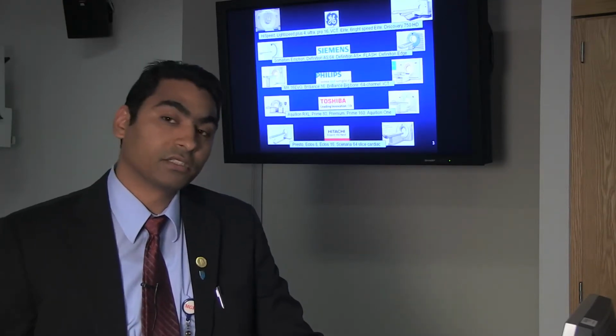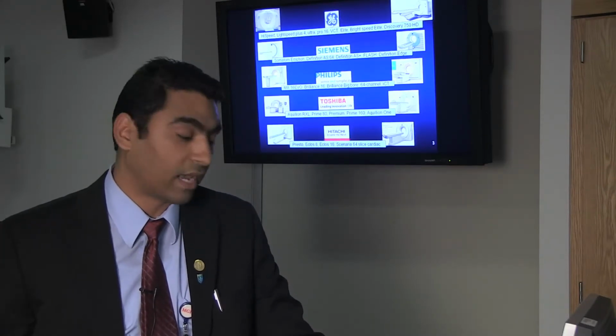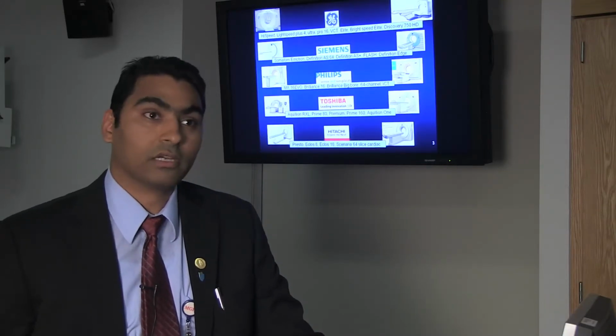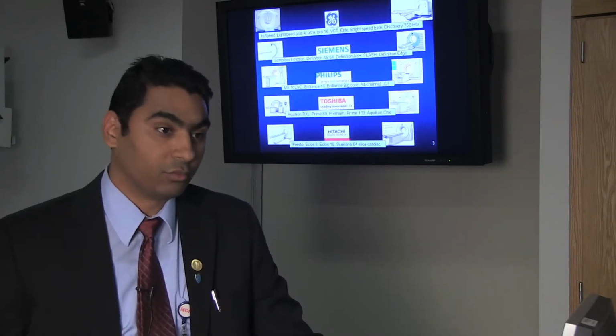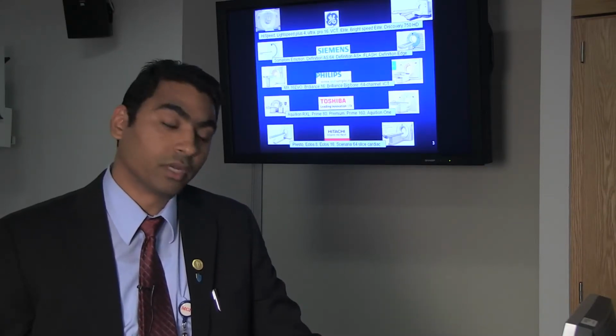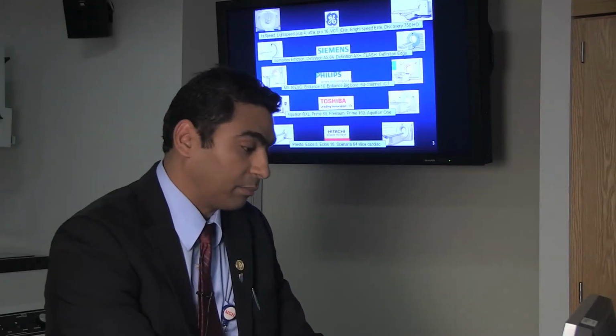the generic definitions of these scan parameters, especially when we are trying to compare across different scanner models or from different institutions, or we recently learned about a new research study or a new protocol and we want to implement the scan parameters from one model to another. So it's very important that we understand the generic definitions of these scan parameters.